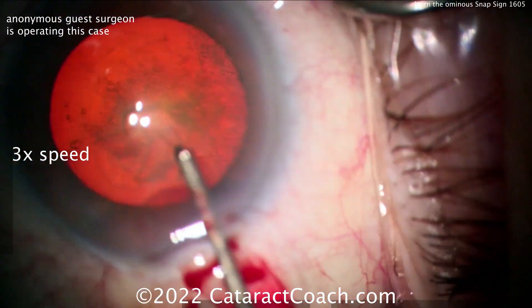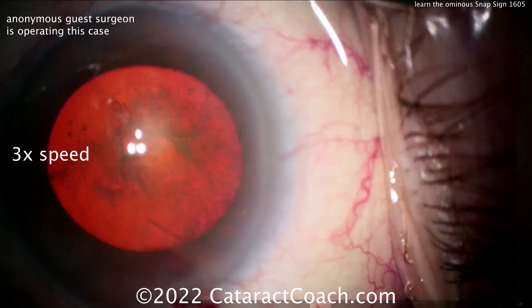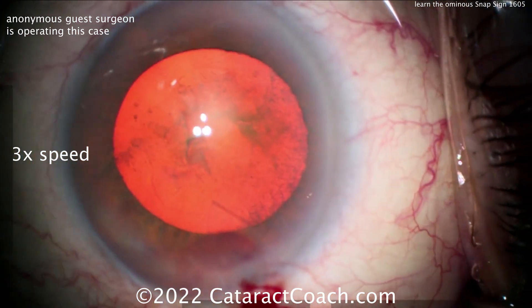Watch carefully — we have an anonymous surgeon operating here. This is a normal type of cataract that looks like an intact posterior capsule. The rhexis is completed and that looks great.